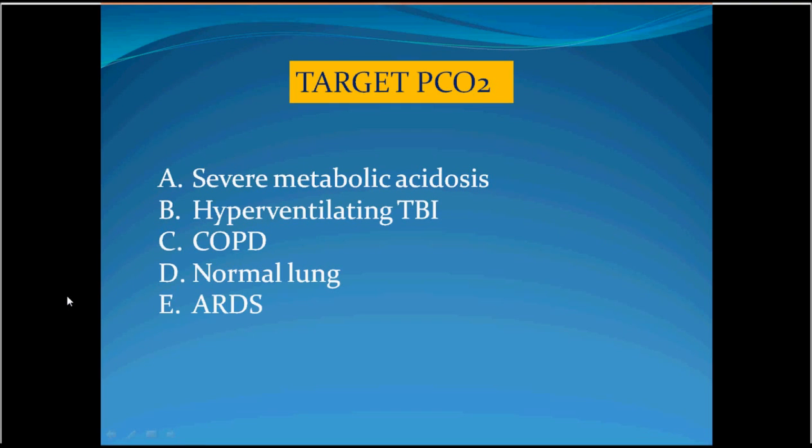We come now to a very important point. You set the tidal volume with its precautions and the respiratory rate with its precautions in order to reach a certain partial pressure of carbon dioxide, or in order to reach a certain pH. You adjust the tidal volume and respiratory rate according to the state of the patient.